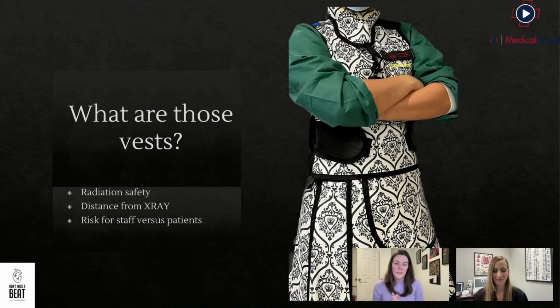Wearing these types of things is really important to protect you. Patients are in there for an hour or two, sometimes a little less. Our exposure over time is compounded because this is what we do for our lifestyle. So you will see people walking around wearing these, some have flames on them, these really cool design things. They just protect us for our job and reduce our risks of having some radiation related complications.